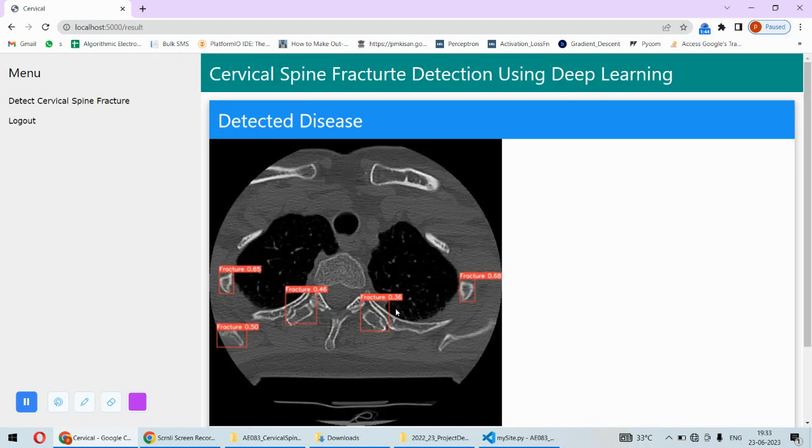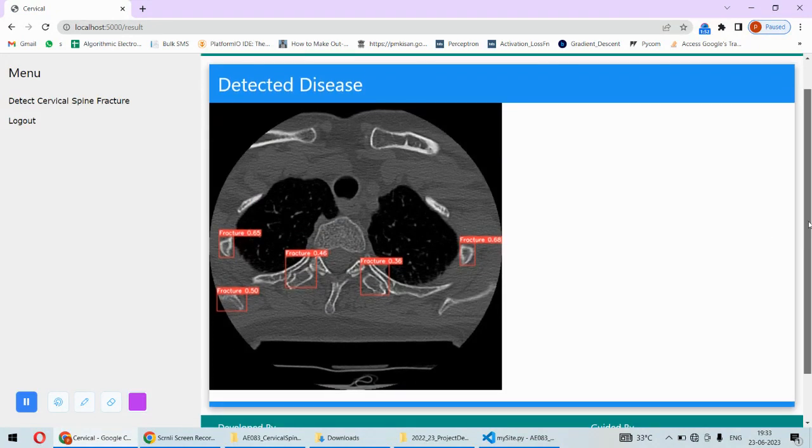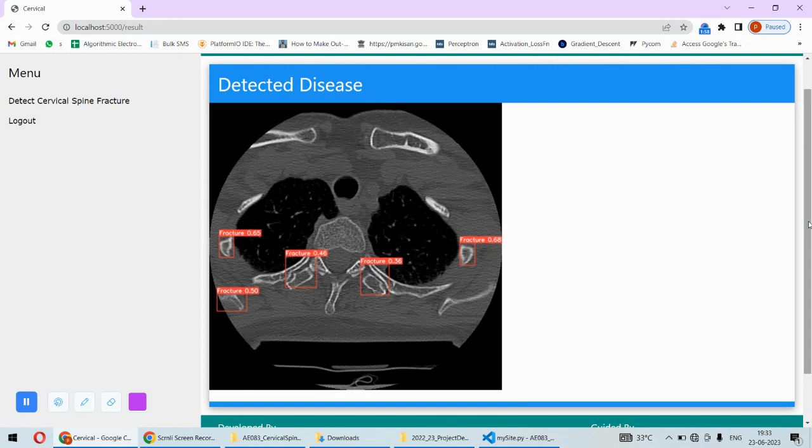Wherever the fracture regions are located, these are the regions where there is fracture. This can be identified by using this particularly important technique. For this purpose we are using the YOLO object detection or the YOLO model.